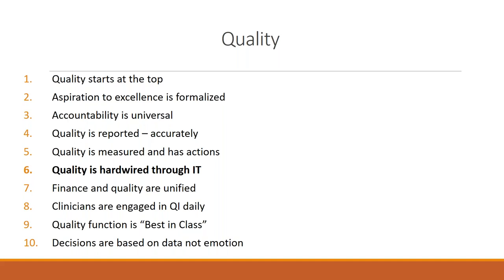Clinicians are engaged in QI daily. If the right programs are in place, the doctors are now doing peer review, or review of their own work or their peers' work, on a daily basis in their normal workflow. It used to be, again, a manual process where you'd have to pull things and set things up. Now it's hardwired within the programs themselves.